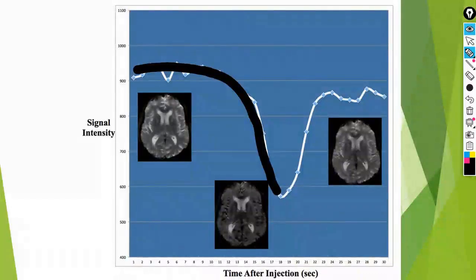It's normal for vascularity to be regular. Do you understand me? It means that the contrast agent doesn't stay in any part and anything that comes out of the kidney, so there must be a washing out from the tissue through its blood flow. The circulation continues normally. So when it exits the tissue, will the signal intensity increase or decrease? It will increase. Why will it increase?